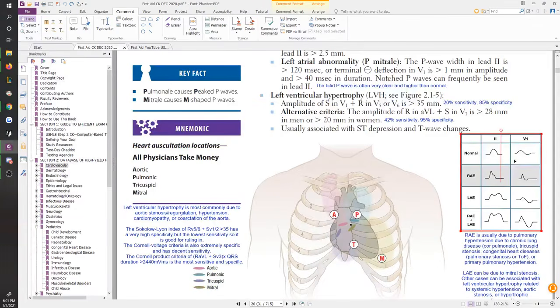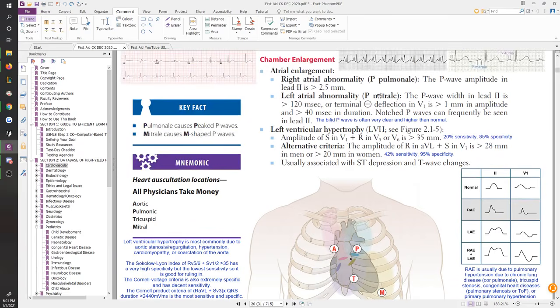Right, so this table here summarizes some of those things we've looked at, right? You have your normal lead 2 and normal V1. That's just how they look. V1 does point up, and V1 is tiny, okay? Then you look for right atrial enlargement and left atrial enlargement. Right atrial enlargement, we just said, is where you have your P pulmonale, which is basically a P wave that's very tall, right? And that's what you're seeing there. With your left atrial enlargement, that's called P mitrale, and you look for an M, and you can clearly see the M here, right? In your lead 2.